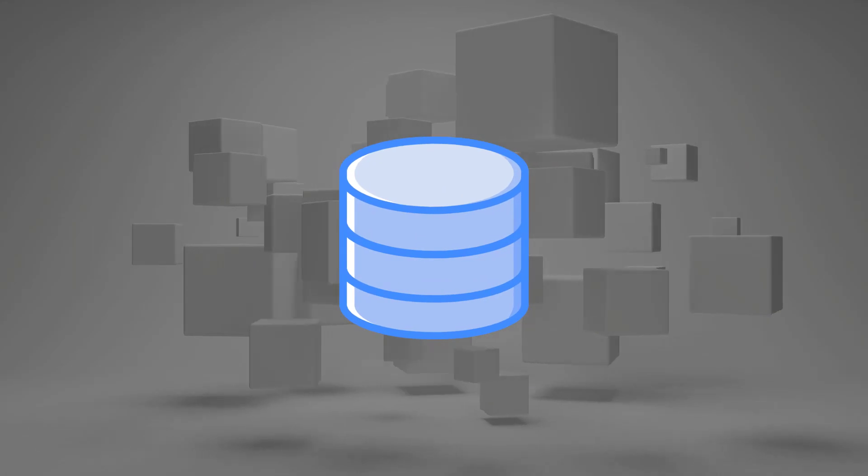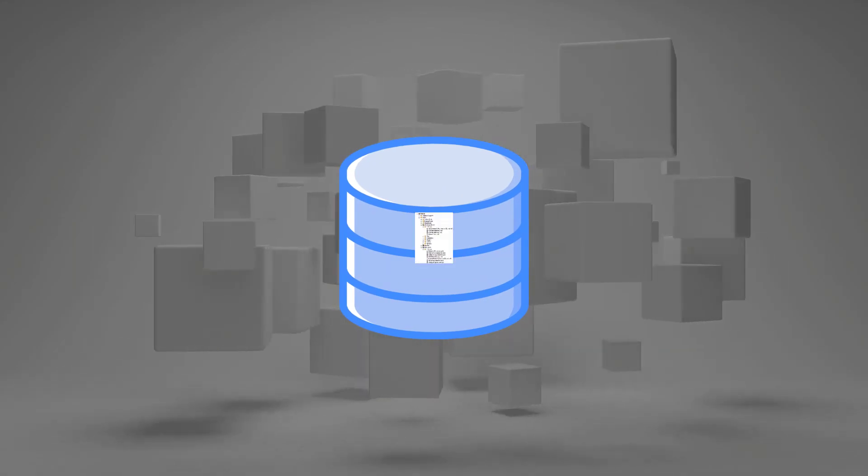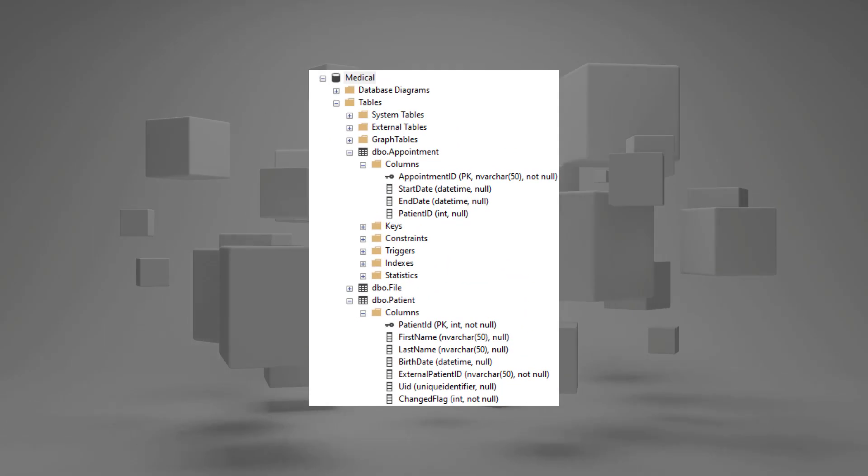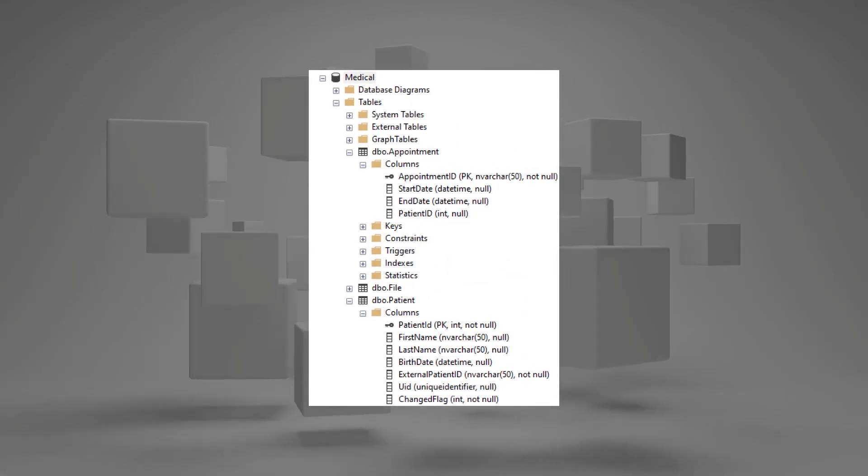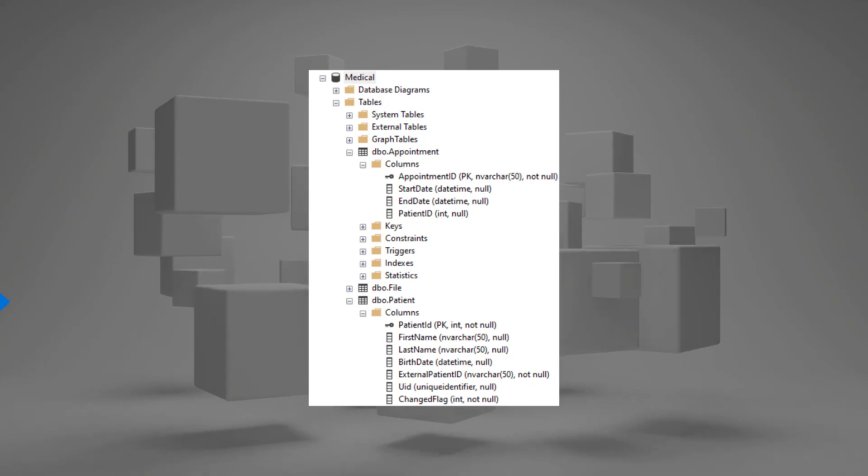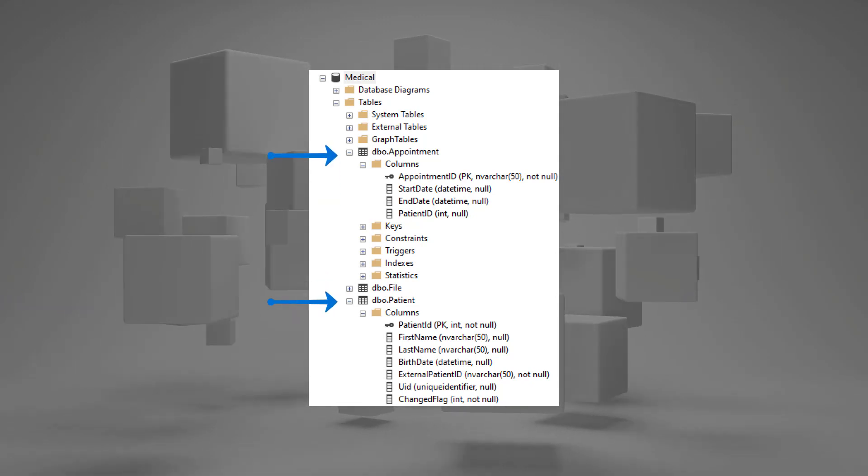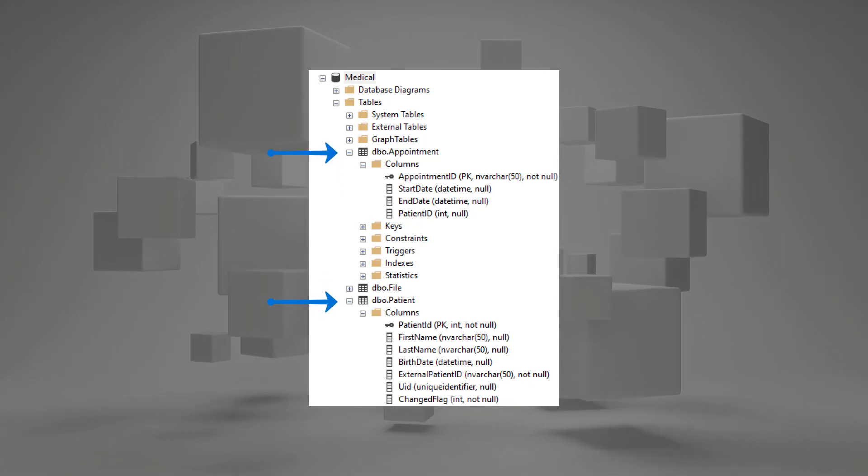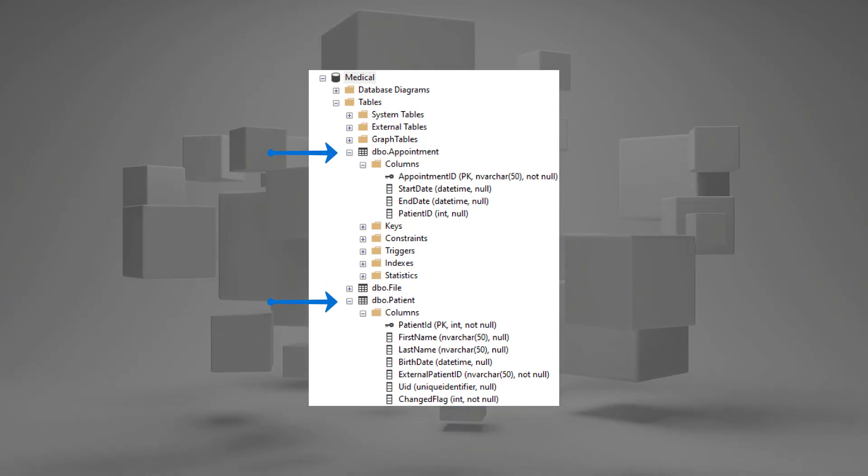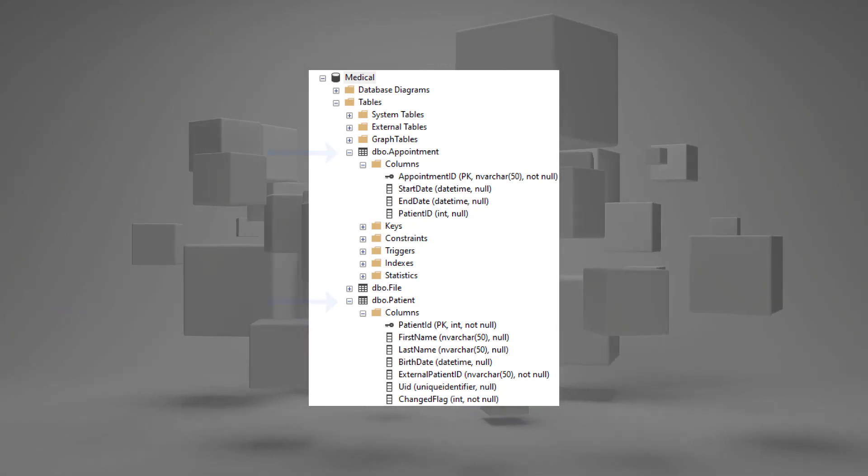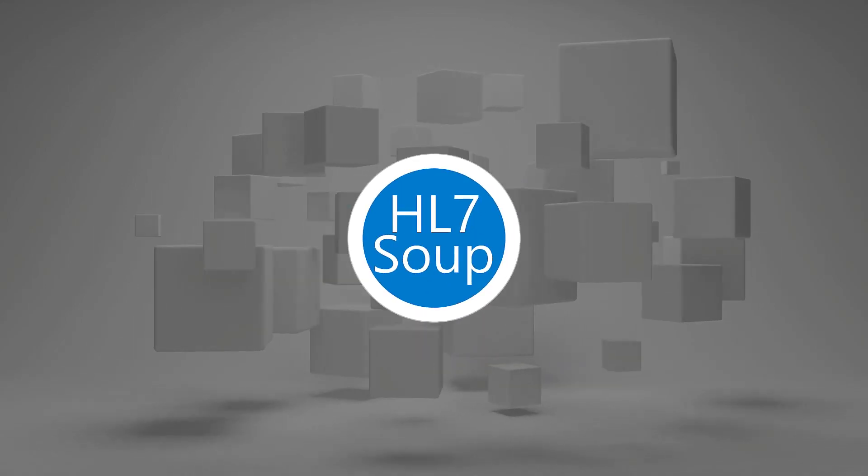Let's start by taking a look at our dummy database. It's very simple. We just have a patients table and an appointments table, but it illustrates a very common scenario when working with HL7.